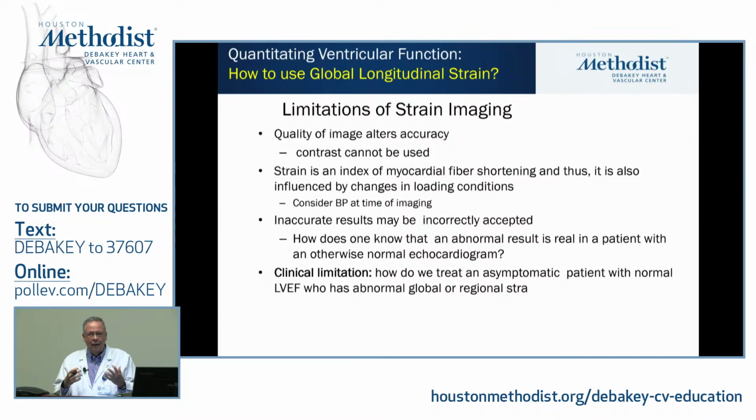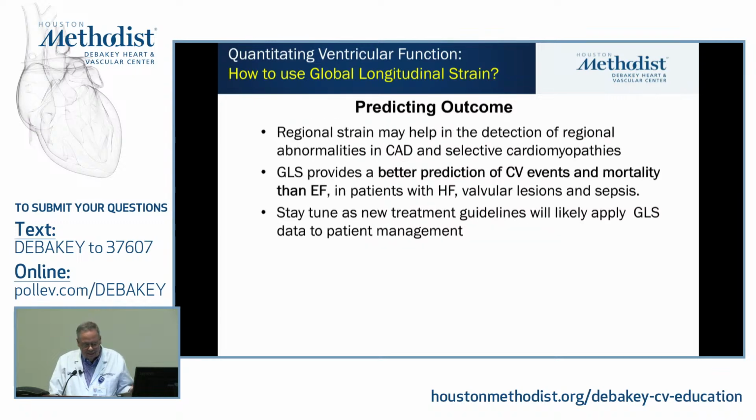In part because, even as a doctor, what the heck would you do with that information? Now, if it's a hypertensive, maybe you'll say, okay, I'll treat the blood pressure more aggressively. But it's just tough to decide what to do with just one number when everything else looks good. So I don't think we have an answer for that one. I can tell you, sometimes I do put it under the table, and I don't report it, because I'm going to create also a confusion on the other side, on the person receiving the report. What are they going to do? So that still is an issue that we don't have a clear answer for.